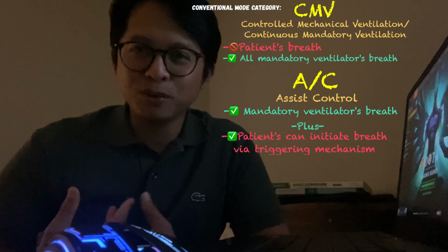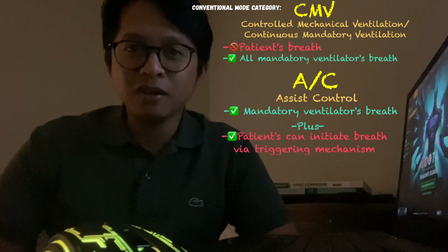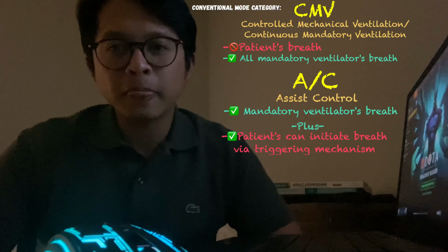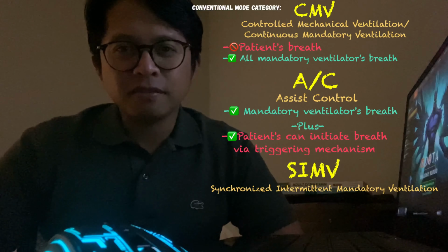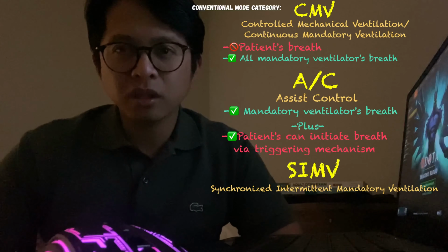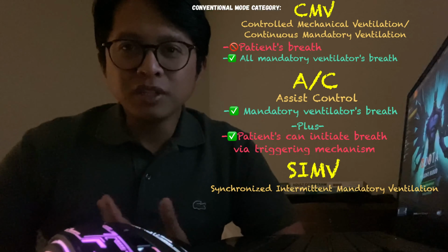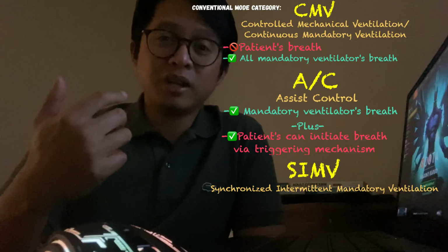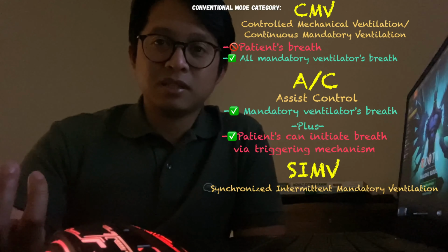The next mode is SIMV, or Synchronized Intermittent Mandatory Ventilation. From the name itself, you already have the idea of what this mode does. The mode gives a mandatory breath intermittently and in synchrony with the patient.